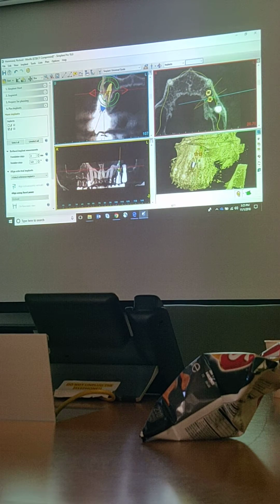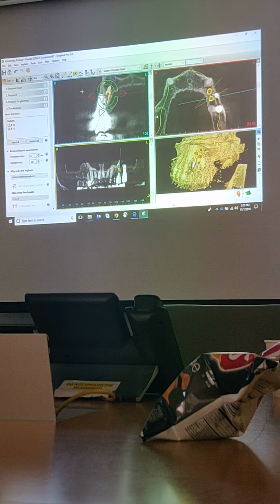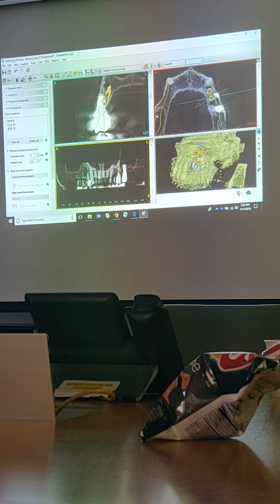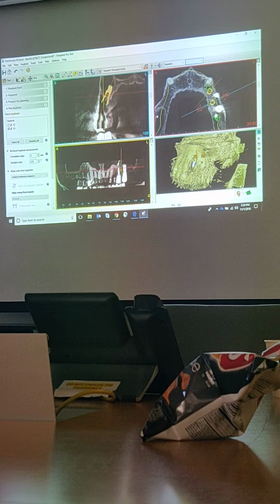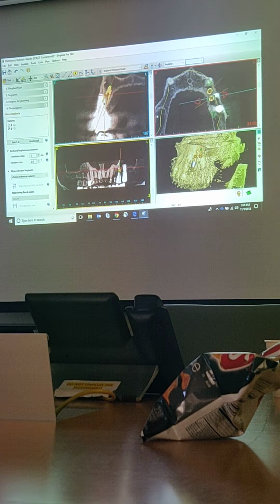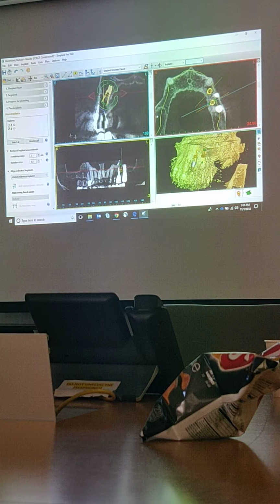If you had a case where you actually have bone there and no sinus interference, you can maintain everything else, and basically just the spatial relationship needs to be changed, that's all. Parallelism should be maintained. So you can go in here and say, I'm going to move it 2 millimeters. It's just a quick way to produce the second implant without going through all the other steps. And then you can go back and tweak it. Yes, you definitely can do that, and then you want to make sure you go back into the same thing.